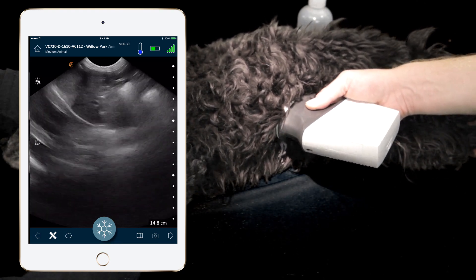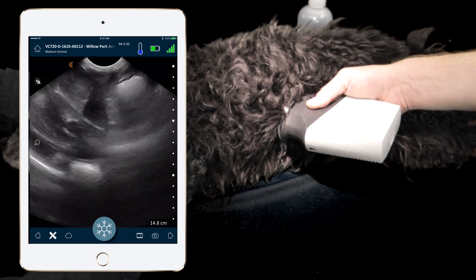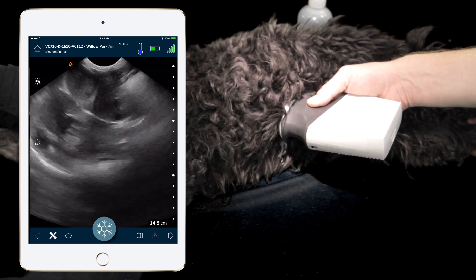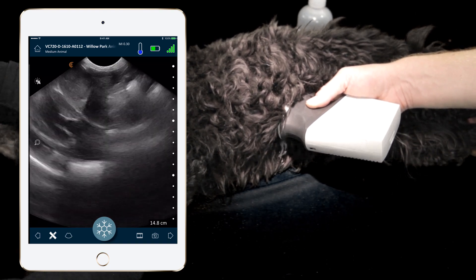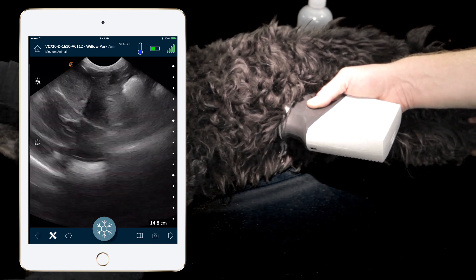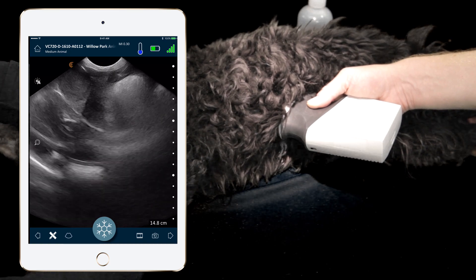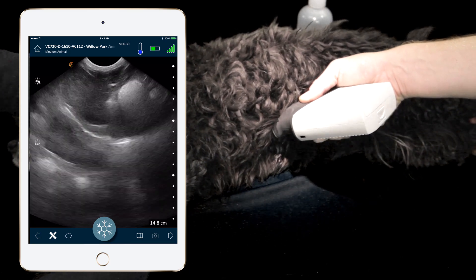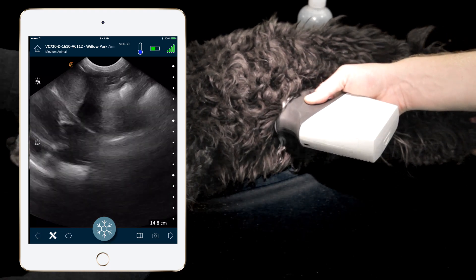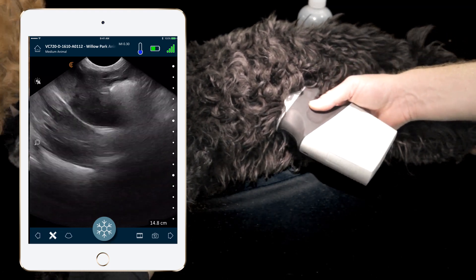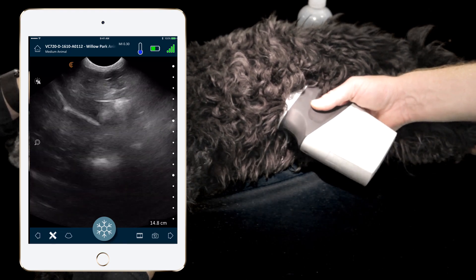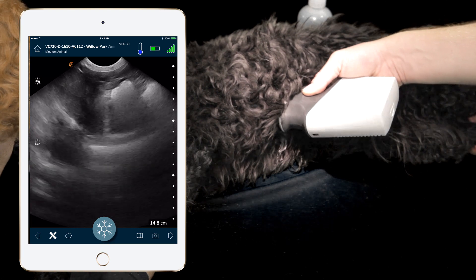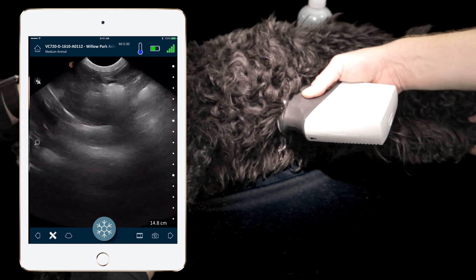We've essentially ruled out pericardial effusion. We also compare the right ventricle to left ventricle size subjectively and assess the mitral valve. We have a good view of the mitral valve, left ventricle, and right ventricle. Scanning all the way across both sides and focusing on the far field of the diaphragm, we see mirror image artifact and no fluid in the pleural space. This sub-xiphoid view, shared with the abdominal FAST exam, is excellent for assessing both pleural and pericardial spaces.